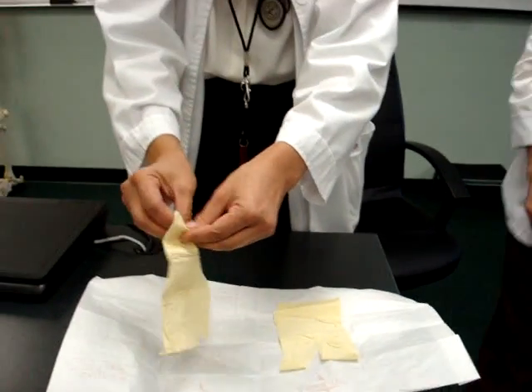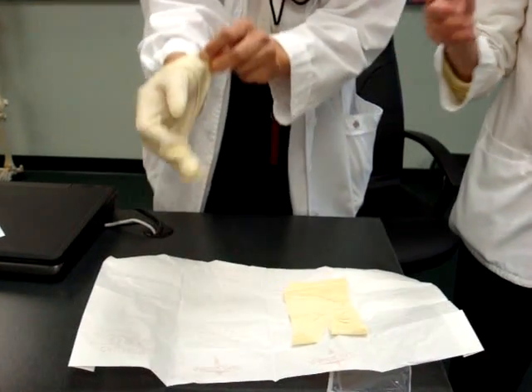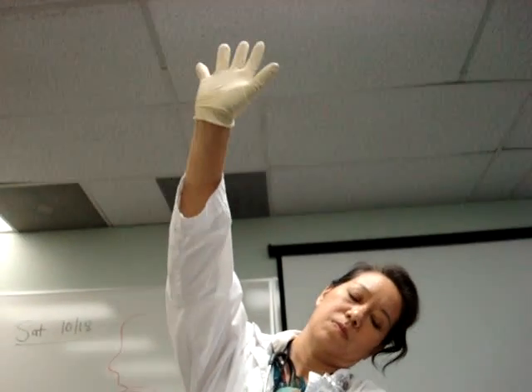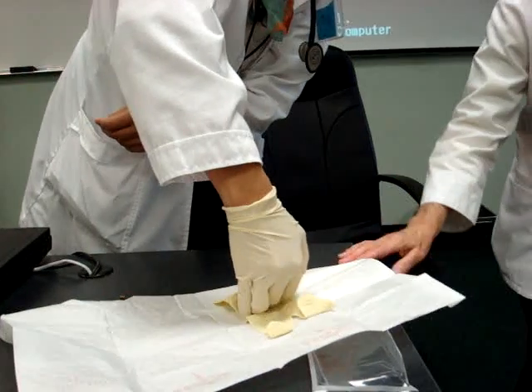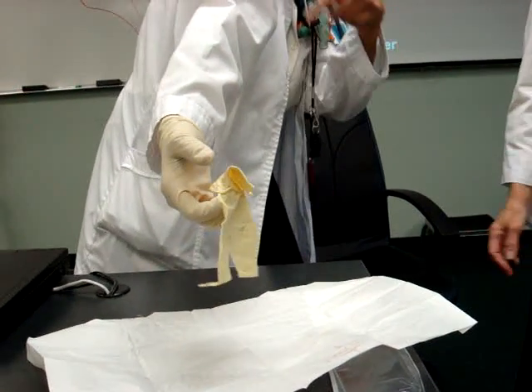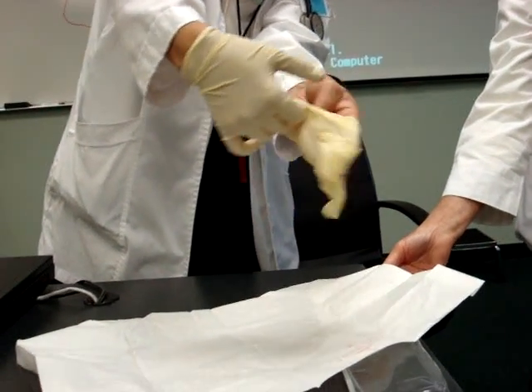So she's going to grab which part of the glove — the inside or the outside? The inside, because her side is the inside. And then now, which part of the glove is she going to touch with her sterile glove? The outside, underneath the cuff. She can hold a couple centimeters around the edge of the field.